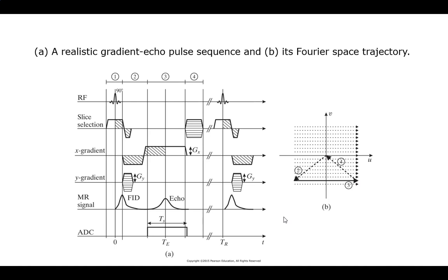Okay? So what we want to do is we're going to take, notice I don't give it any amount of impulse or anything. Right? So what would the advantage of selecting that slice be? Because that's all the Z does, right? It just selects that slice. Could it ramp up the frequency of whatever's oscillating to bring it down quicker? So it'll come to equilibrium faster.